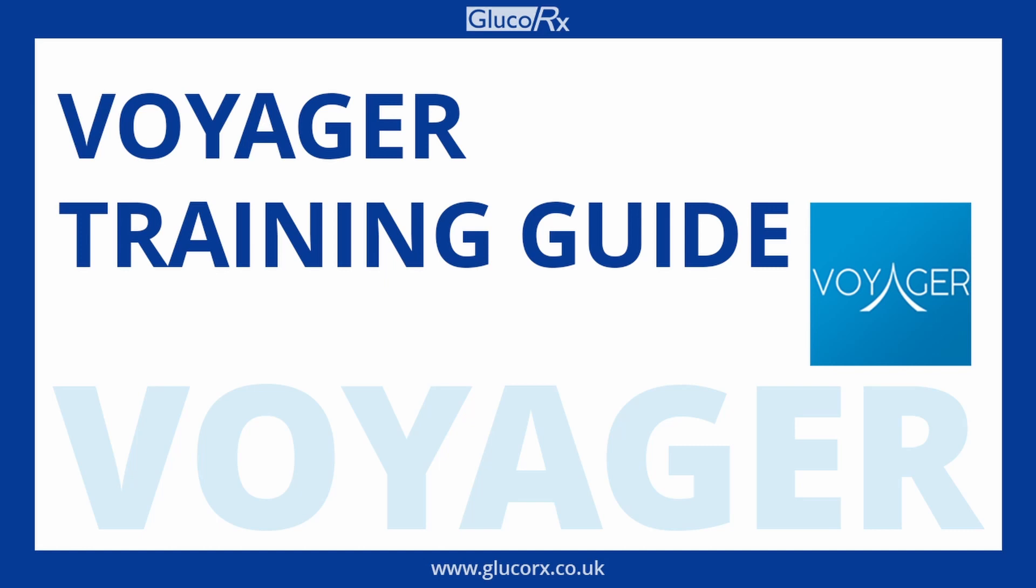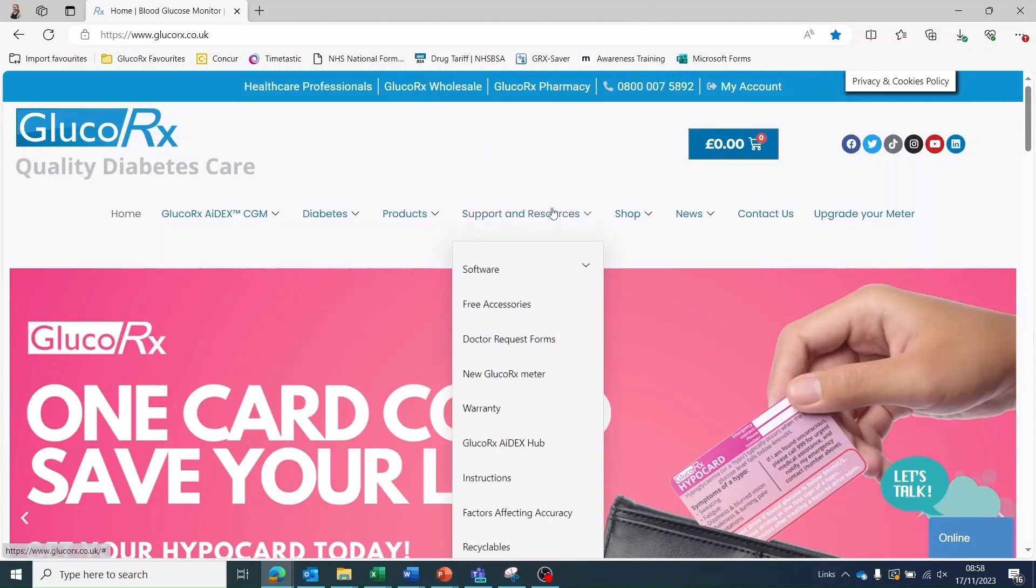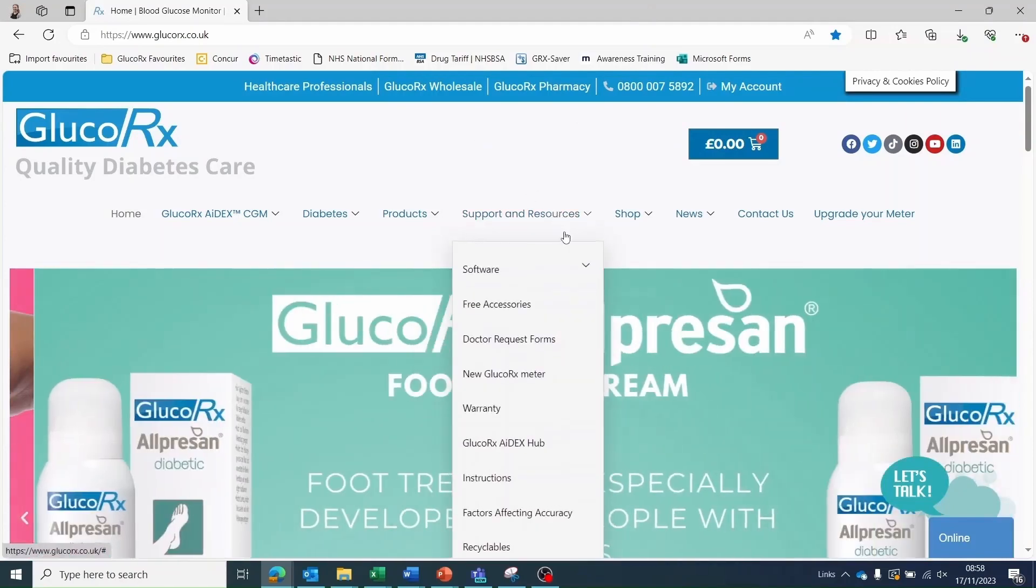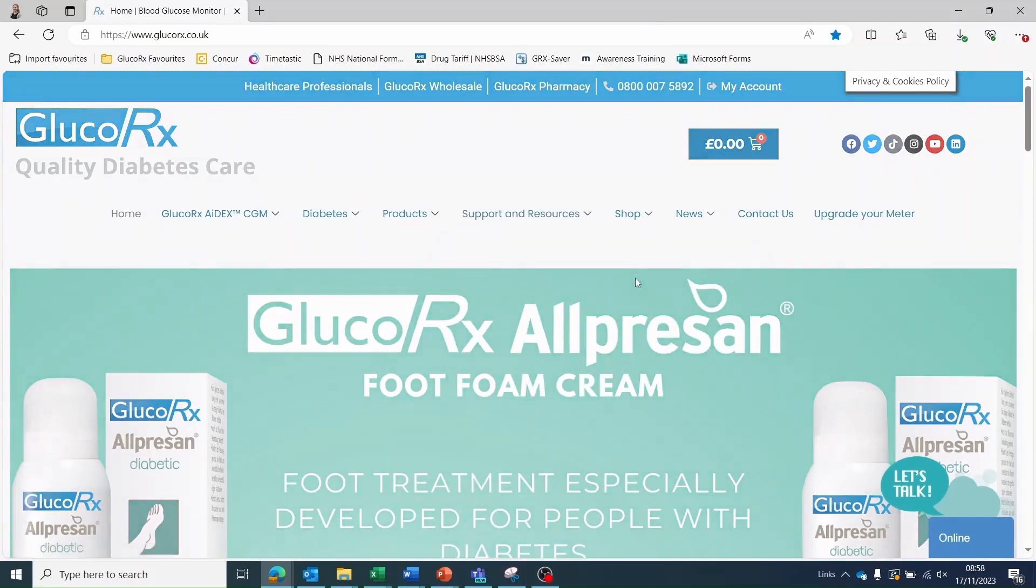The GlucoRx Voyager software is available to download via the main GlucoRx website. Select the support and resources tab, then software, then GlucoRx Voyager.